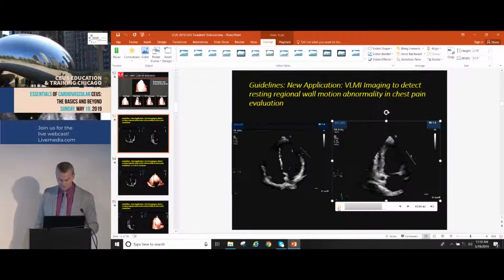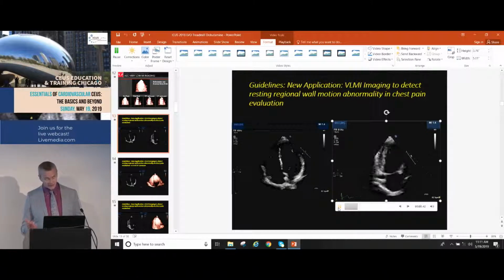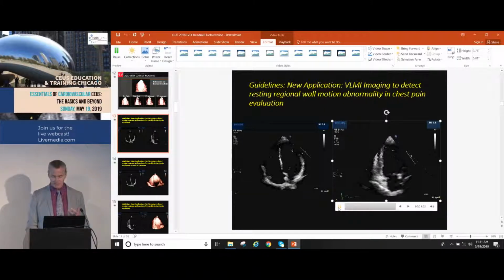This, we probably should have turned a little bit more. You still see a little bit of right ventricle there, but inferior, a little concerned about that. Well, our sonographer knew that I was reading. Sometimes when it's a real good window like this, they decide whether to use contrast, depending on who they attend, because they know that we'll always ask for contrast in certain settings. When it's evaluation of chest pain, we tell them we really need contrast because we need to be absolutely sure.